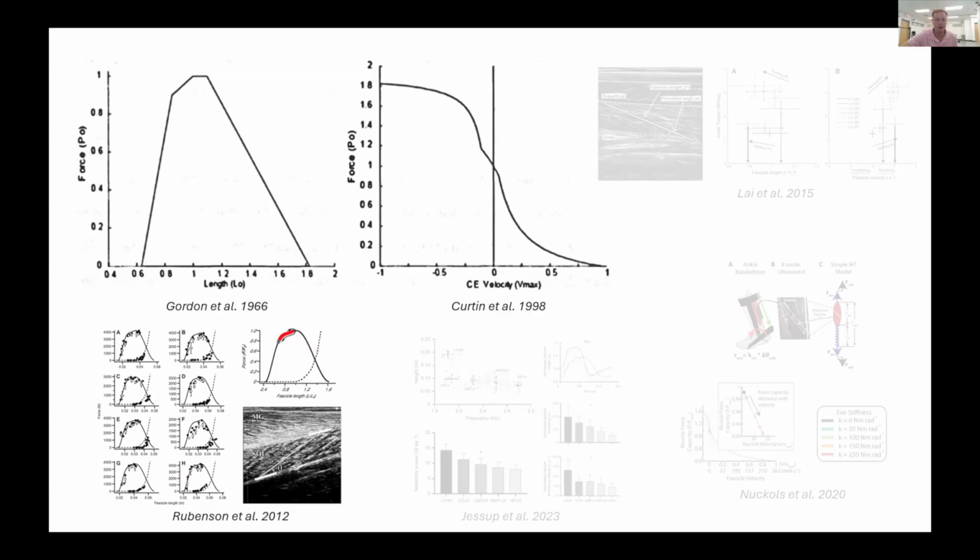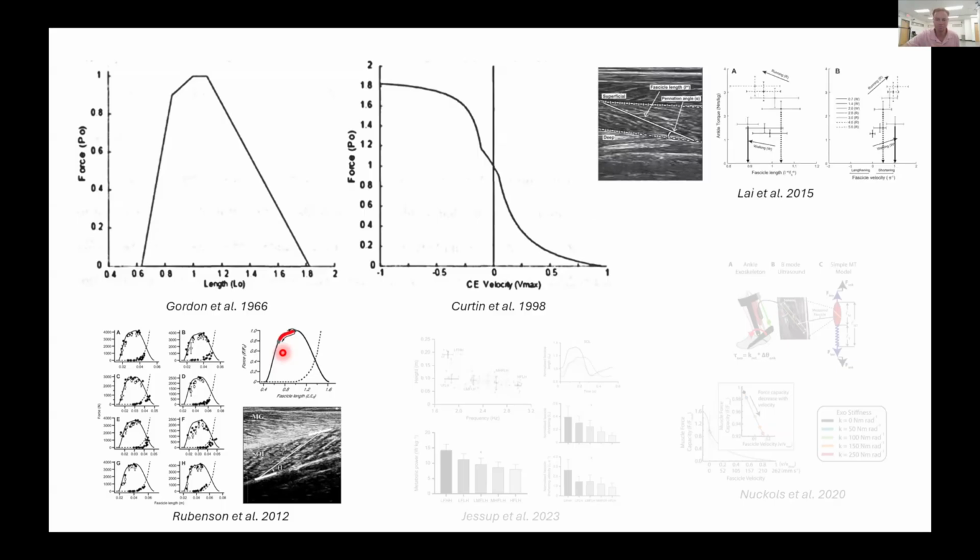And you can see that on average, it sits around this ascending part of the plateau here, which would be potentially ideal in terms of balancing between force production and making sure that there's room for muscle to still lengthen, say in the case of perturbation needing to be resisted, or having to minimize injury risk due to rapid stretch or high force.